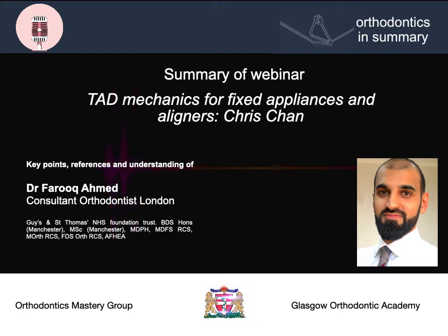Chris went on to speak about extraction cases. Now, the challenge with extraction cases and aligners is that we're more likely to have anchorage loss than is planned, and also the upper anterior teeth are more likely to extrude, and he gave his references which have been summarized.